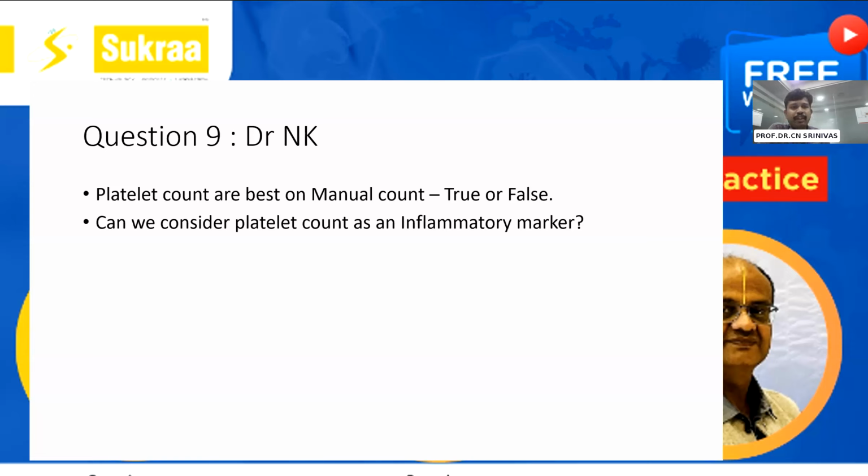be verified based on your smear review criteria of your particular lab to rule out pseudothrombocytopenia, maybe due to clumps or in case sometimes large platelets, platelet satellitism, and so on.